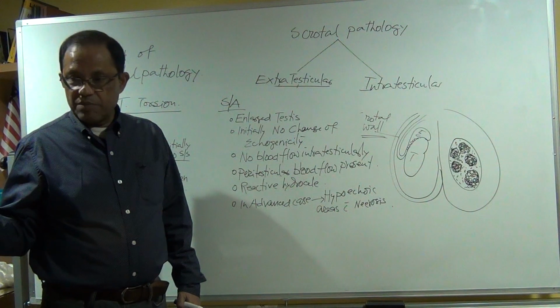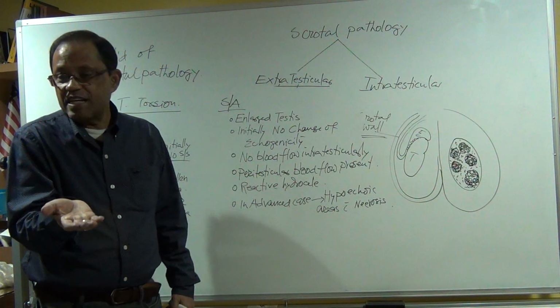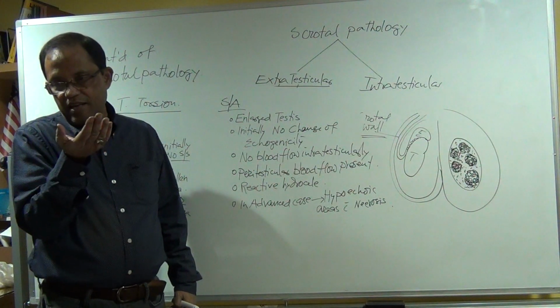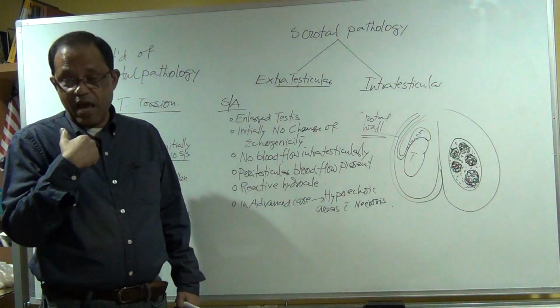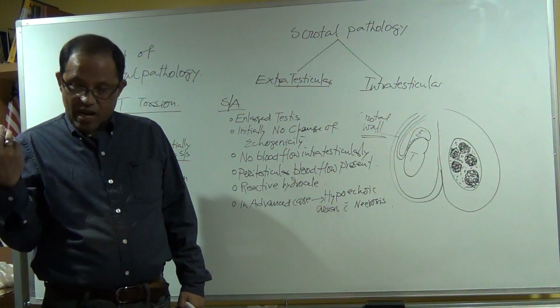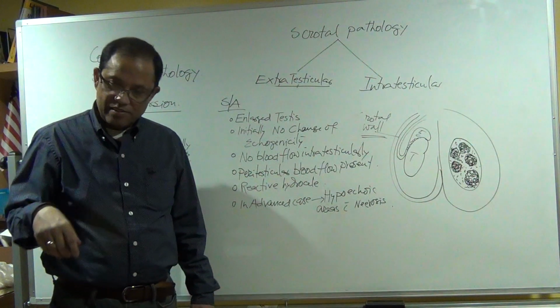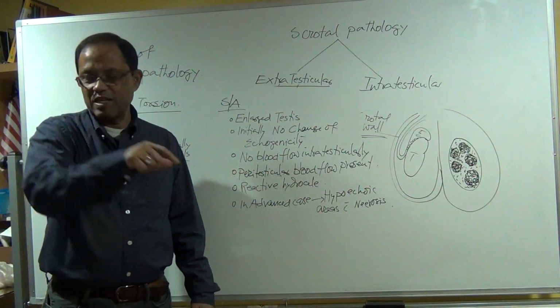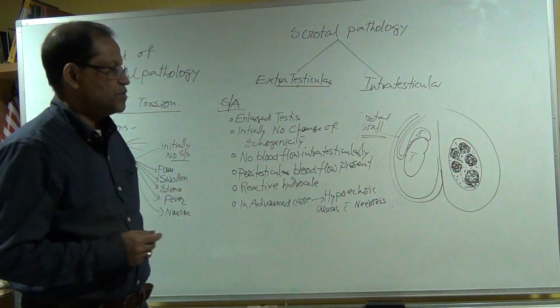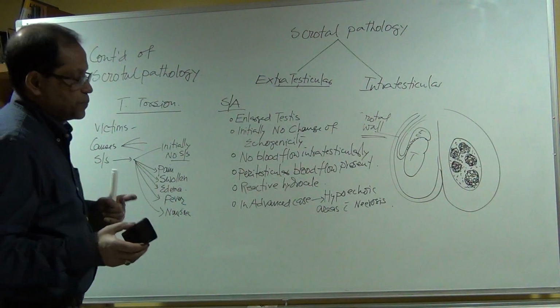I am understanding because I feel the intratesticular pressure, the resistivity index is going high, and I am having difficulty sending the blood into the testis. At one time, the testicular artery will fail to supply the blood to the testis. So the testis will die. Okay, keep that in mind.